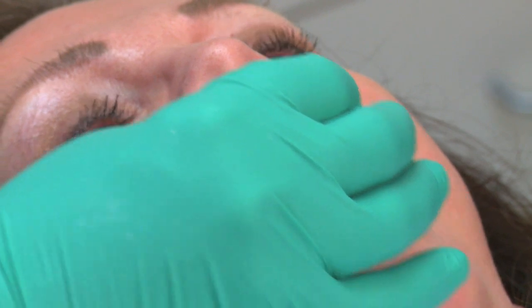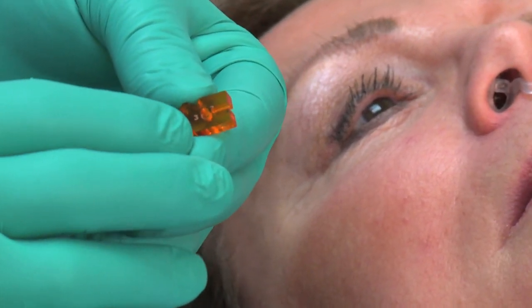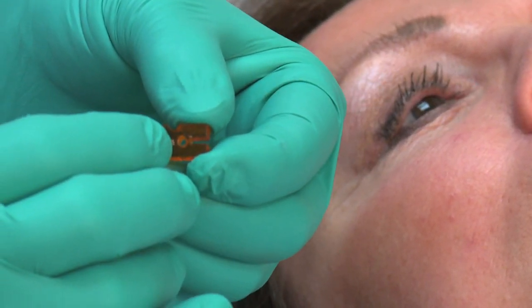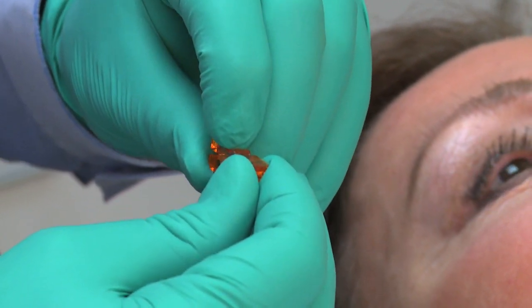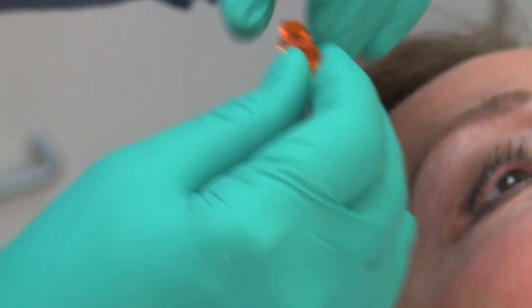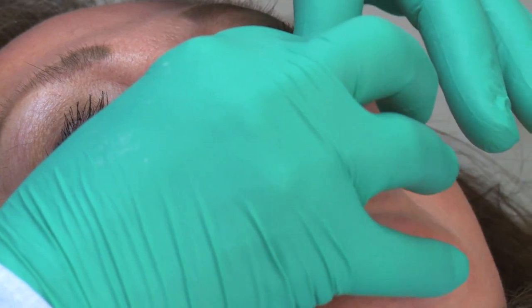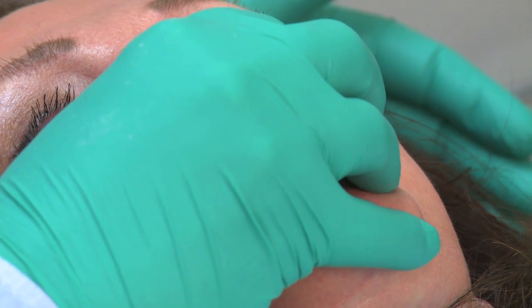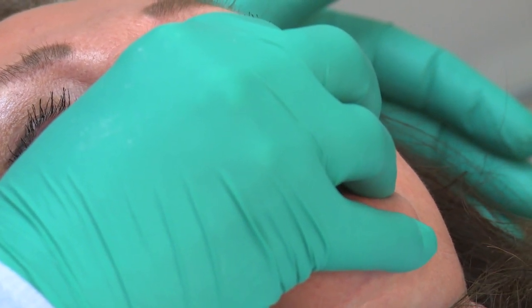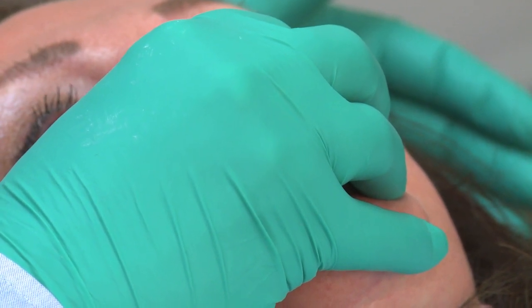And open. Let's add 3 millimeters of horizontal movement. So we're going to turn the key. The 3 has to face the patient's throat. Maxillary teeth in this notch. And she moves into, wait 1 second. Okay, go. Move forward. Good. Seal your lips. Snore. Not hearing anything. And open.